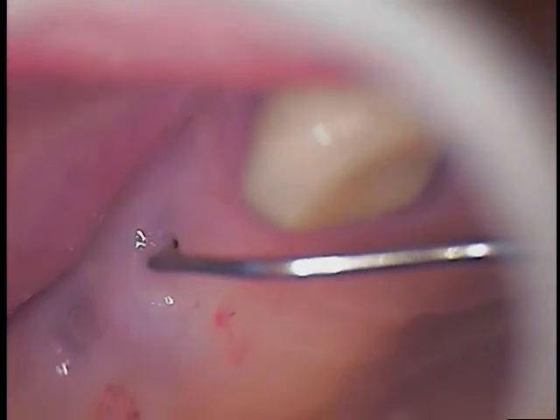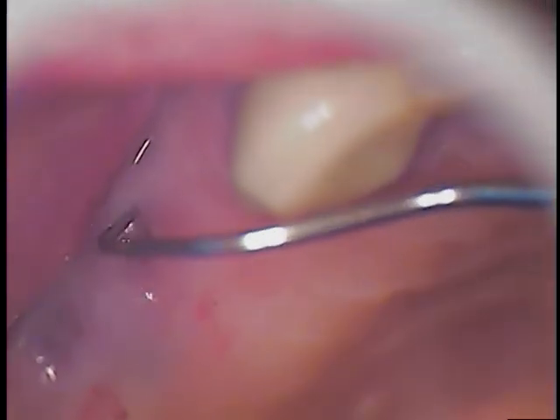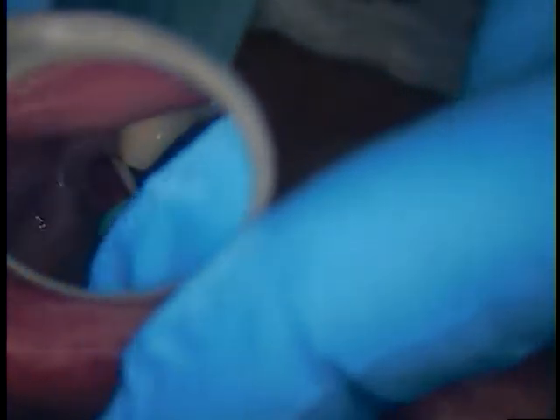So we do have a small little tissue punch. I use the explorer to find the middle — it looks like the middle portion is right about there, so we'll do a nice punch through the top. Coming a little bit on the side of the connective tissue, more palatally than facially. See if I can avoid the facial on this.